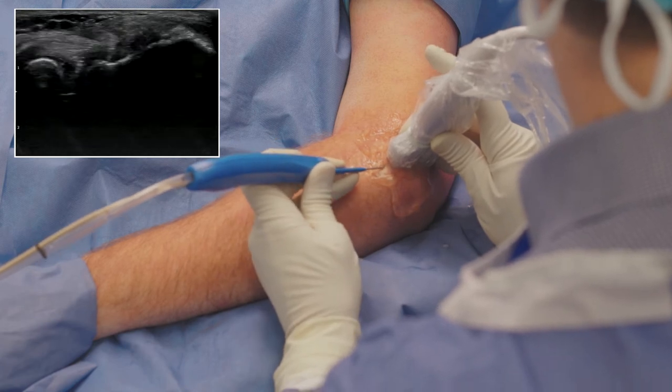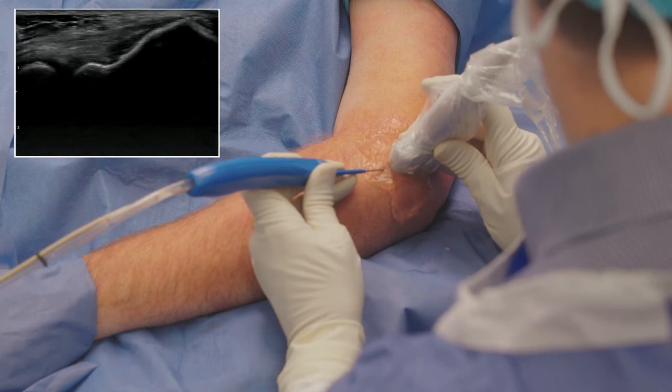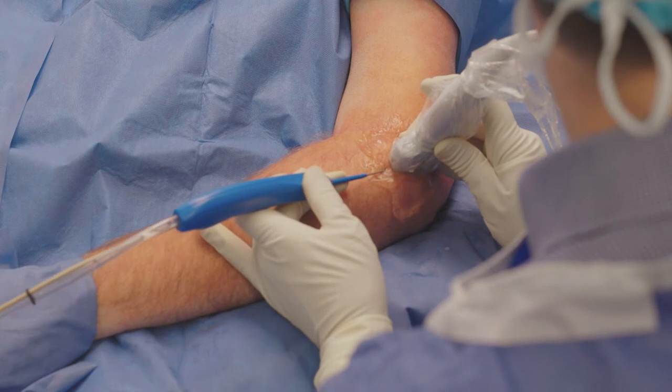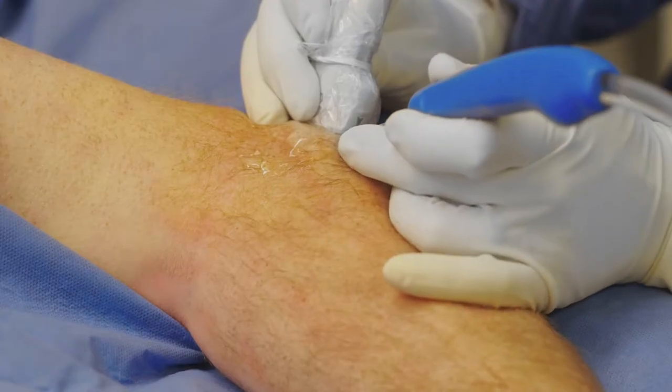As you can see on ultrasound, the TenJet device is going towards the diseased tissue I have identified. I have placed the TenJet device at the extensor mass origin and depress the foot pedal to start debriding the diseased tissue from the site.